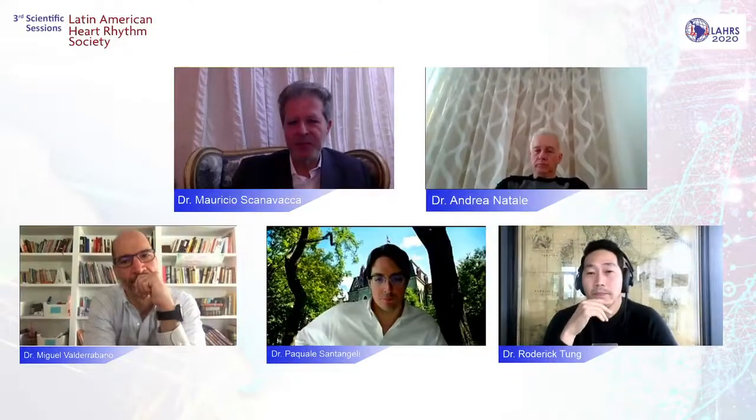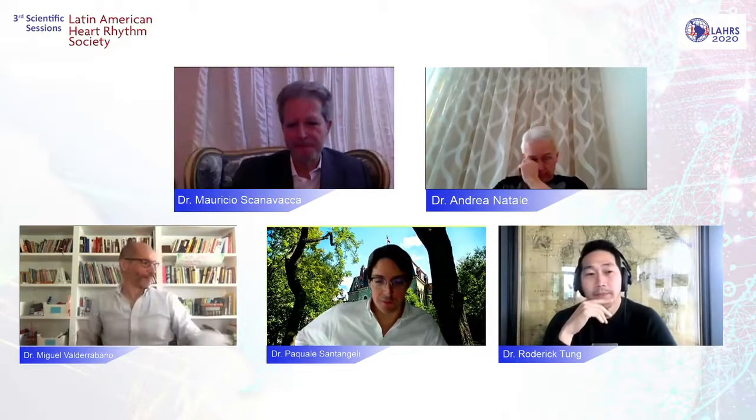Great, thank you. Pasquale? Yeah, so first of all, thank you for the invite. I enjoyed the session and being here. So septal flutters, typically the way I approach it is whenever something doesn't make sense, usually it's coming from the septum, and that's the very first thing that we look at. The high density activation map works beautifully for a lot of flutters. It doesn't work well for this type of flutters, in my opinion, because all you see is an early septal breakthrough, but then you still have to use entrainment to understand where to deliver your energy. And then we call it flutters. I don't know what the mechanism is. I assume it's re-entrant in some, others may be focal. There is no way for me to tell really. They look focal from a surface mapping, but we don't know.